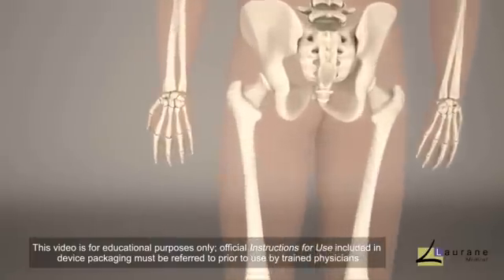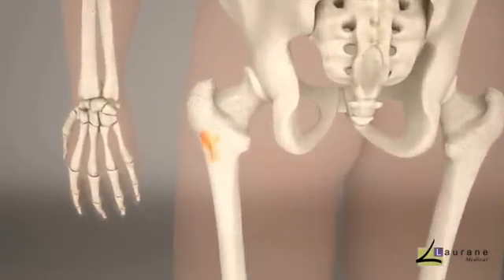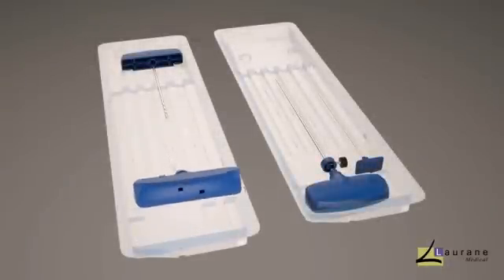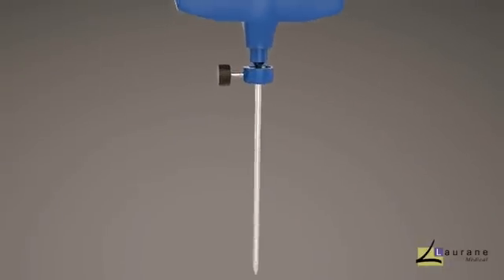Under diagnostic guidance, the targeted lesion is located and the correct path and distance determined. The easy to adjust depth stopper on the introducer is set.